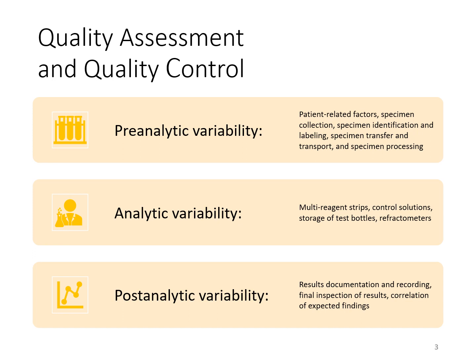Post-analytic would be making sure that everything's documented properly and reported out properly, and that the results from your reagent strip correlate with how the urine appears, as well as with the microscopic portion of the test.